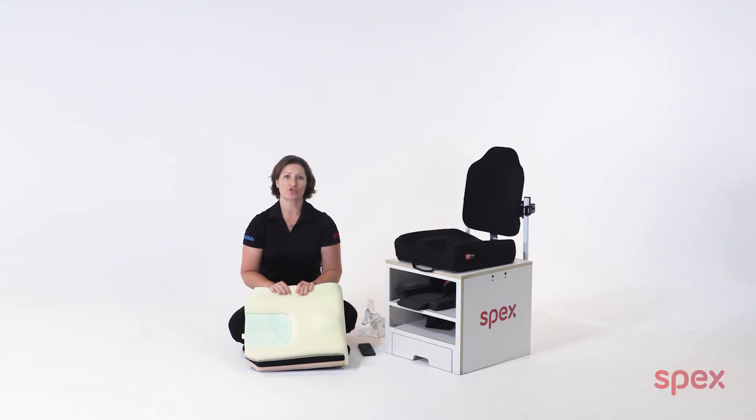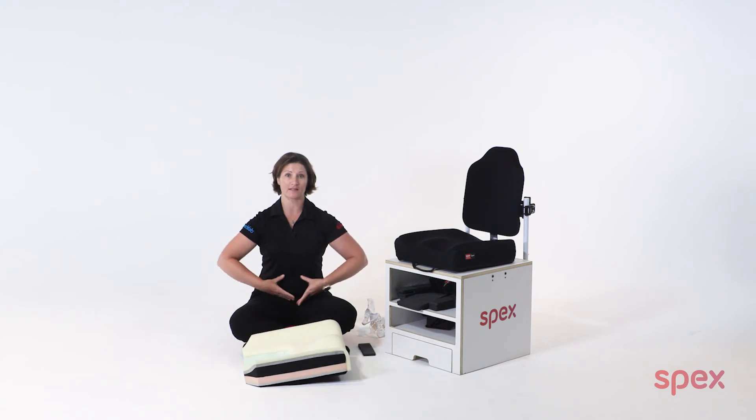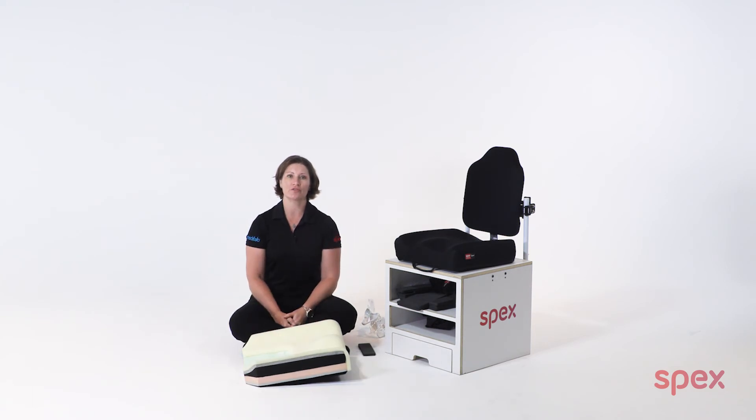It is important to ensure that additional support by way of a pelvic support strap or anterior positioning belt is also considered for users with high tone, extensor thrust, and or posterior pelvic tilt.